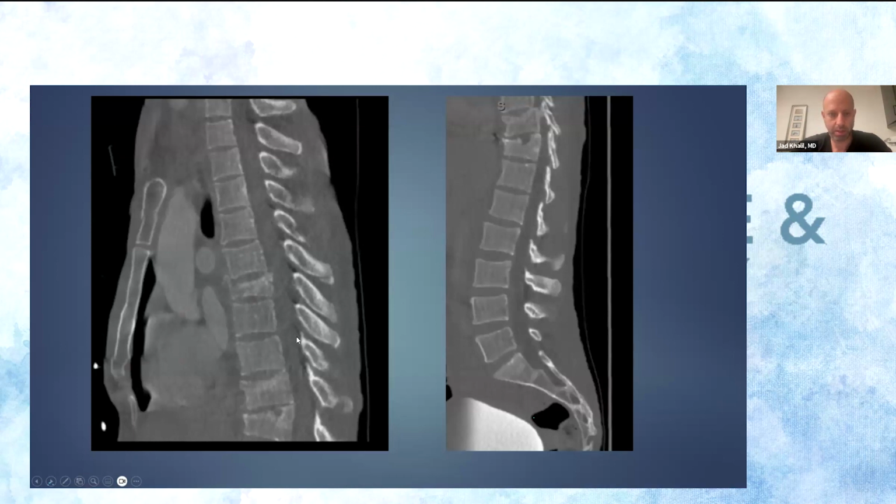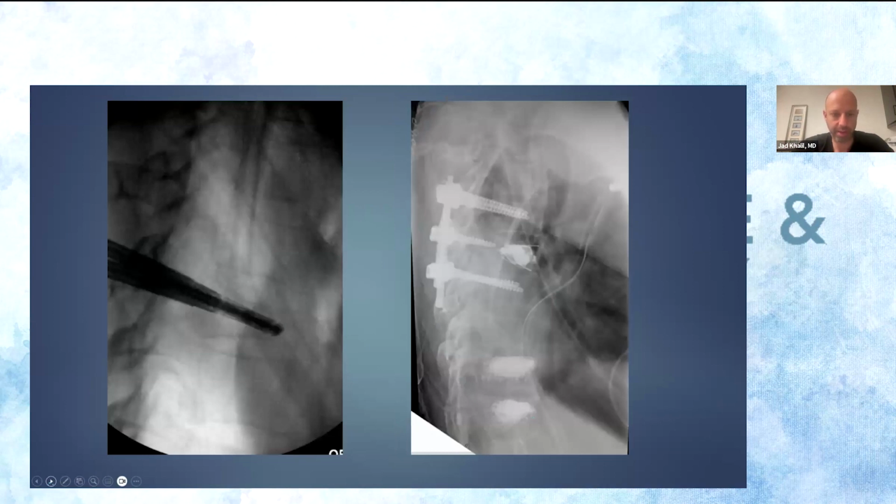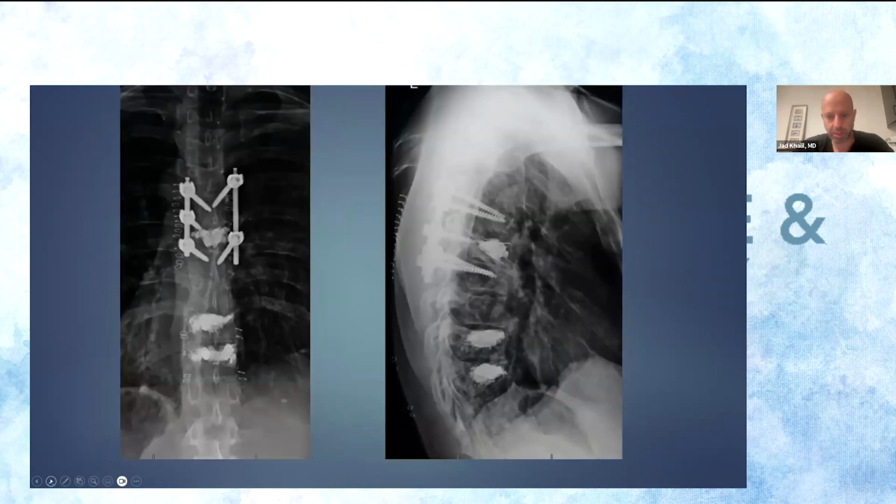And the patient also has two fractures that are a little more benign here. We decided to fix this fracture with SpineJack and fixation, just because of the 3-column or the 4-column injury, if you will, and the bottom ones with a simple SpineJack without fixation. I always do the SpineJack first, typically, just to see how much kyphosis correction I'm going to get, then put my screws, and then I treated the bottom fractures with SpineJack alone.